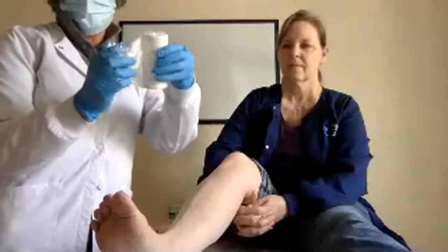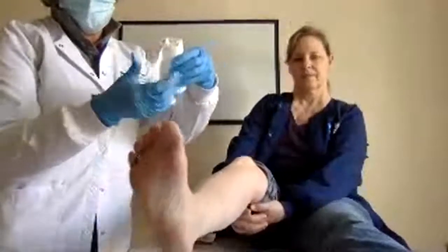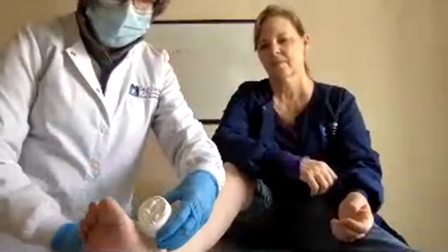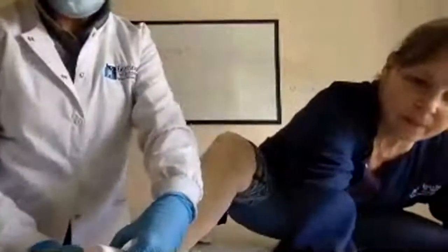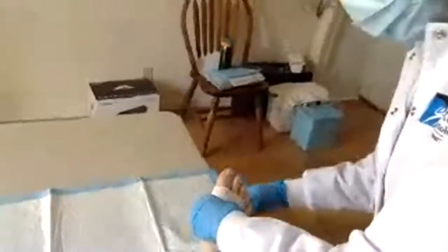And you want to open up the roll, make certain that the edges are not folded over. And what you want to do is start on the top of the foot, and we're going to do our best to show you how this works. You want to get down to the base of the toes. Is that showing? Yes, fairly well.